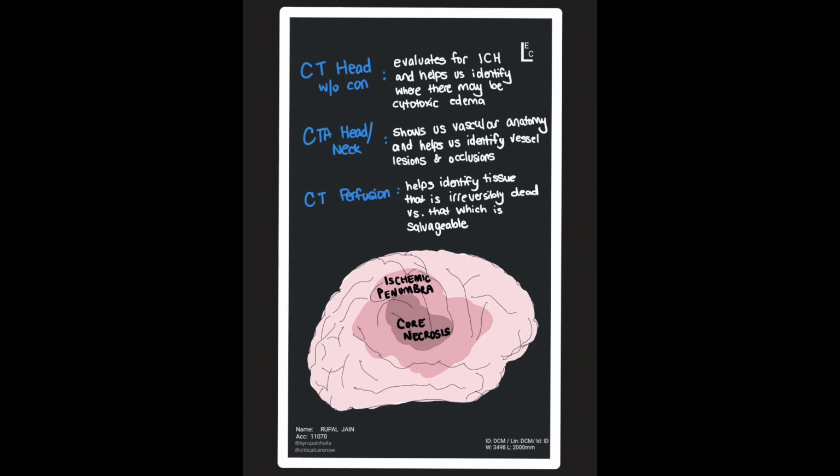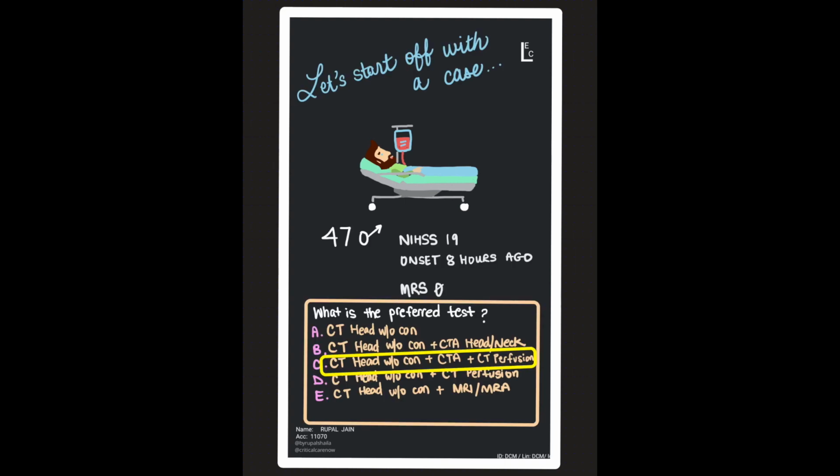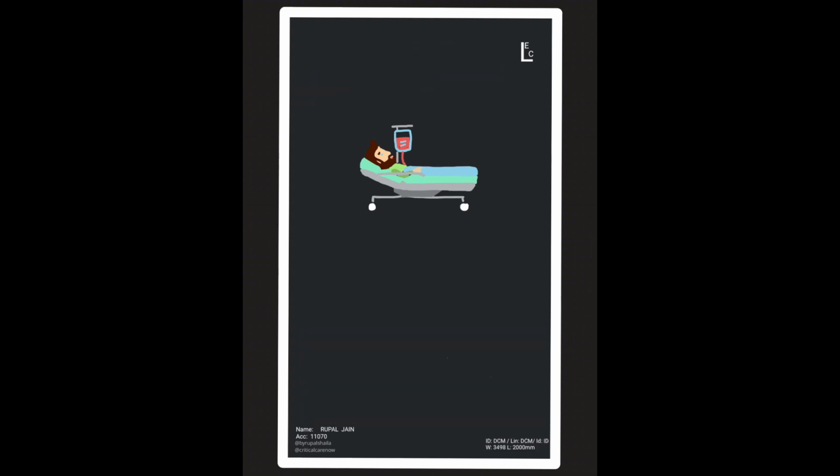So think of the CT perfusion as allowing widening of the reperfusion time window, as our young, otherwise healthy male patient is now going to be offered potential therapy by opening up a vessel, restoring blood flow to the ischemic penumbra. We are potentially reversing some of the functional damage that we are seeing on exam.